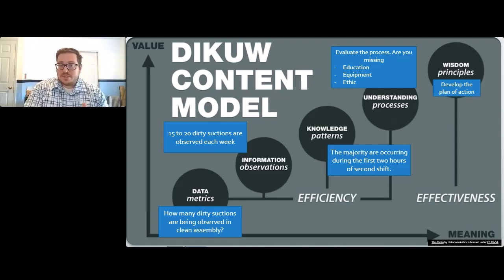So education, that's going to apply to your training. It's going to apply to your precepting. It's going to apply to your standard work instructions for your department, your policies. Those are all resources for education. If there's a breakdown in one of those, it's going to manifest when you get to this process understanding piece. How many times have we seen, I was trained that way. Bob, that's how you showed me leak test scopes. Or they told me I didn't have to do that. So education breakdown.